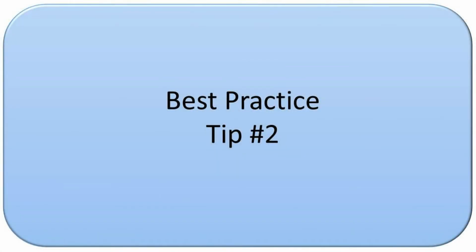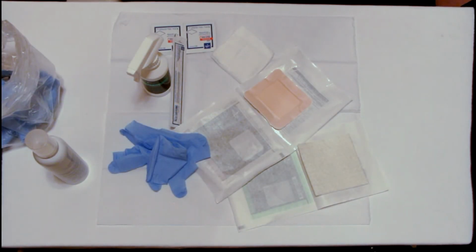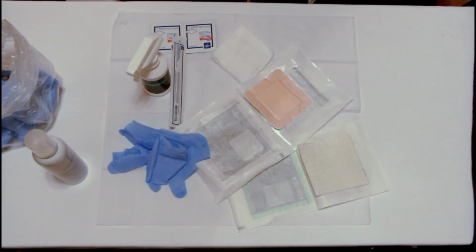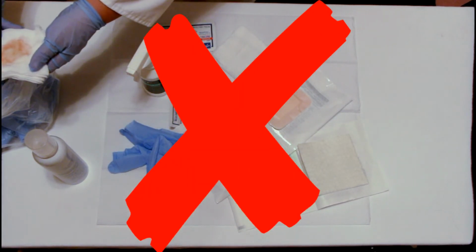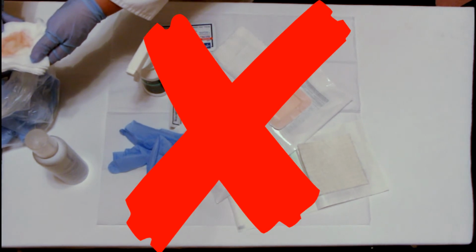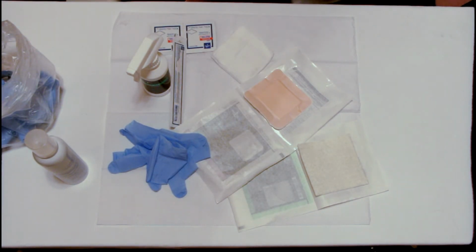Best practice tip number 2. Do not cross the wound care field when performing dressing change. Notice how the clinician crosses the wound care field with the dirty dressing. Instead, the clinician should avoid crossing the wound care field.